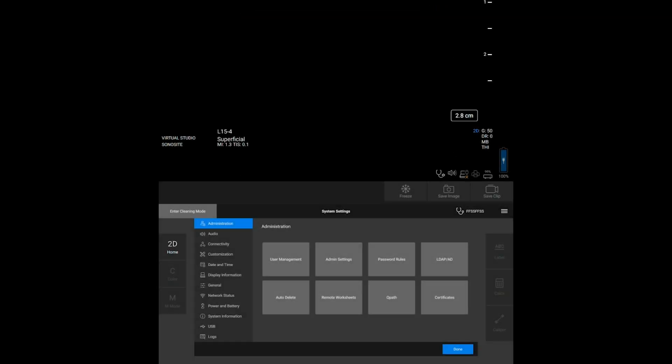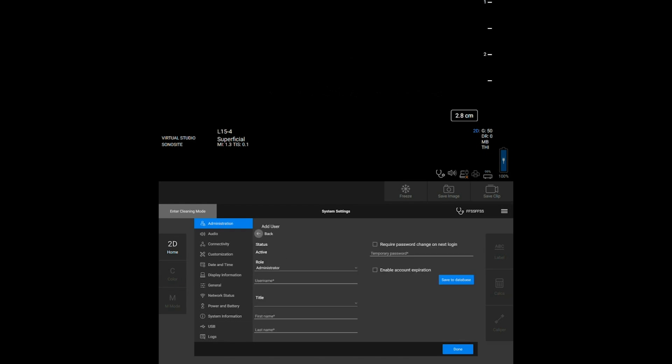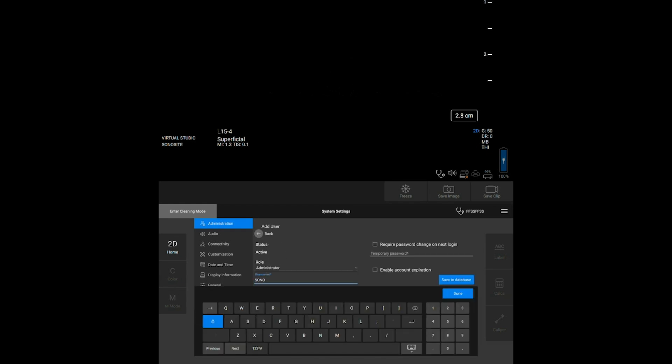To add new users, tap User Management and then tap Add User on the next screen. Fill in user information.